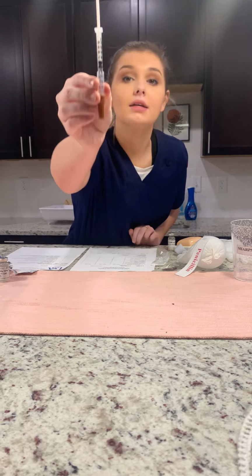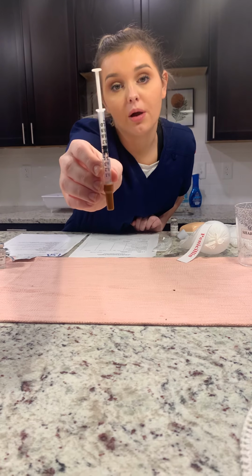And here is 0.5 milliliters drawn up of heparin.